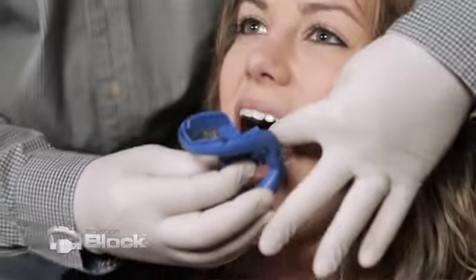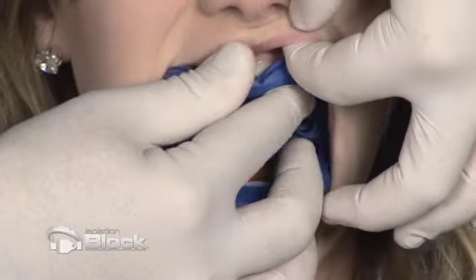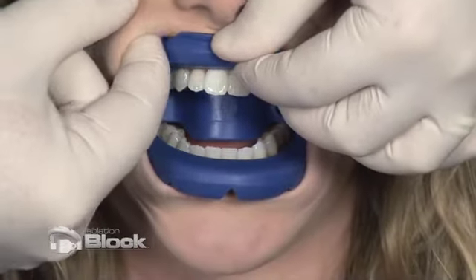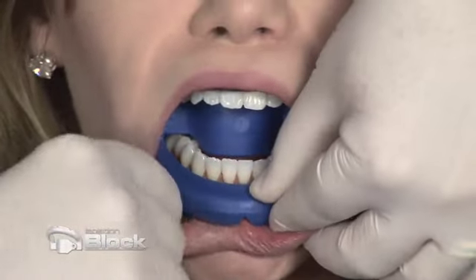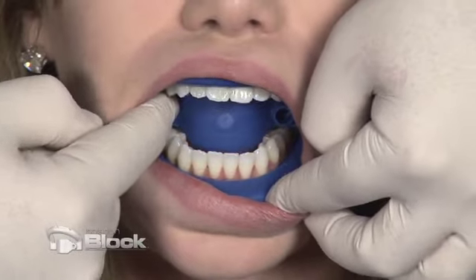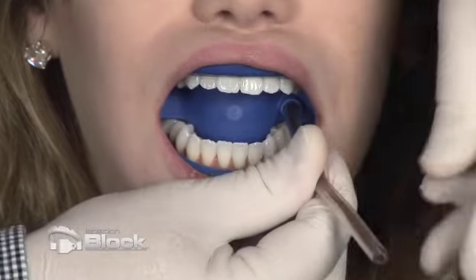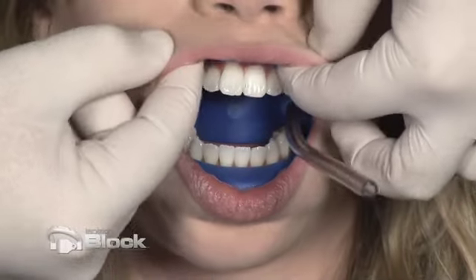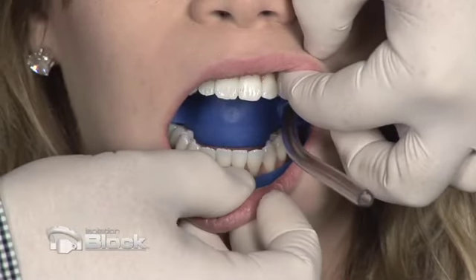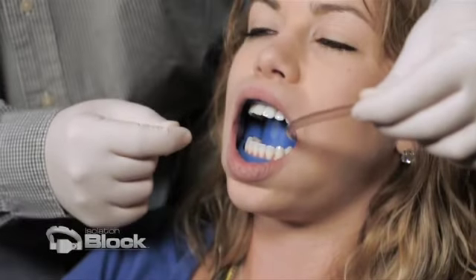When placing this, just get a hold of the tongue shield, have the patient open, slide it back to place, and again you just have the patient bite slightly, pull the lips out around the lip retractor on both arches. Open, there you go. And you place the saliva ejector right in front and connect to the low volume suction. To be sure that's off the teeth. Okay, yeah, go ahead and close right there. As you can see, the patient's resting on the bite block.